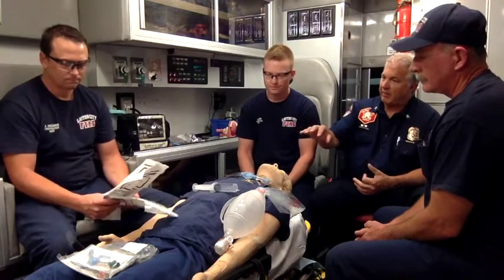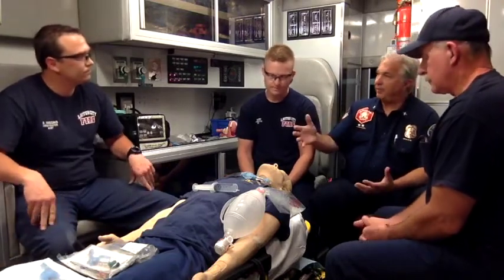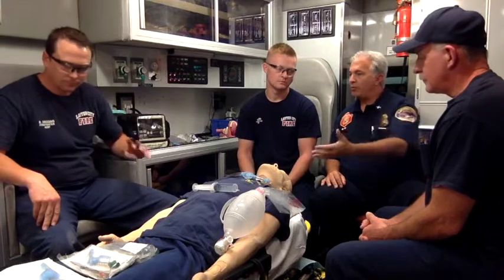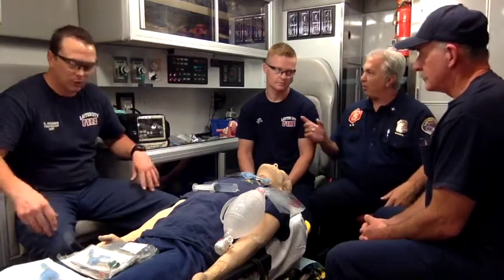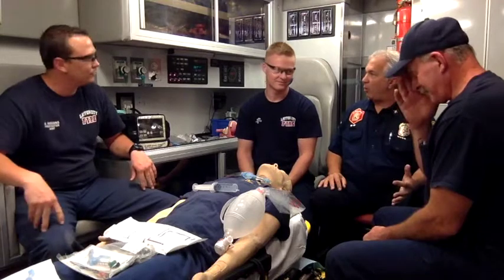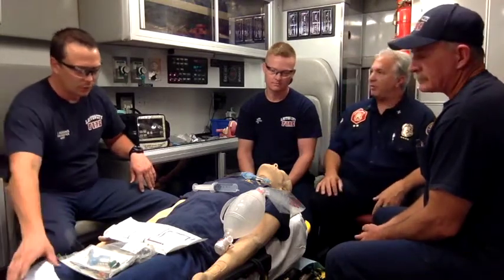make sure you know what sizes we have and some rough estimate of what patient each is going to fit. So like for Val, for example, we should probably all know off the top of our head which one of those airways he can use. What would it be? Number 5. You're saying 4, and you're saying 5, and maybe he's in between. Okay. I was going to say my guess is he's probably a 4. All right, my guess is he's probably a 4. What is the right answer?